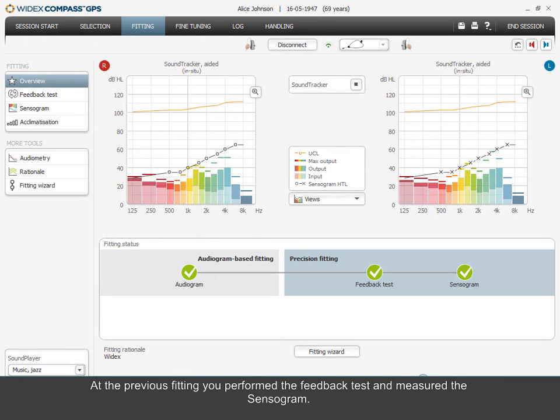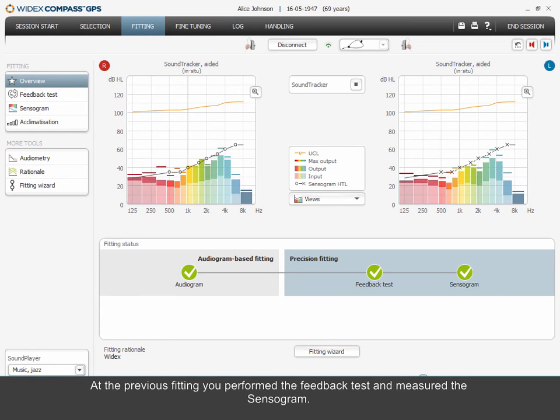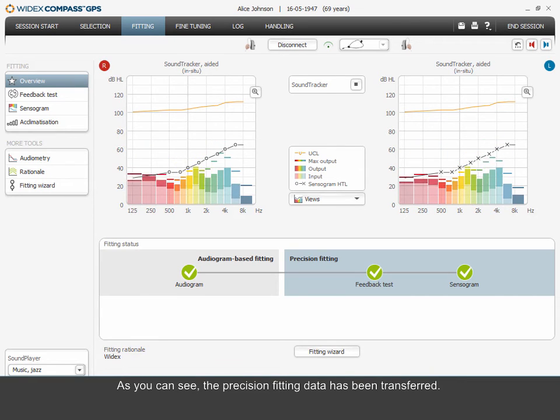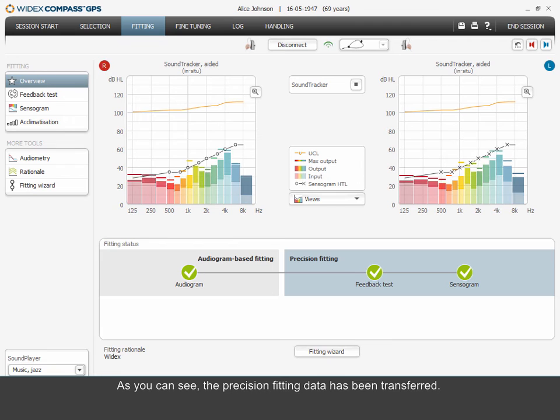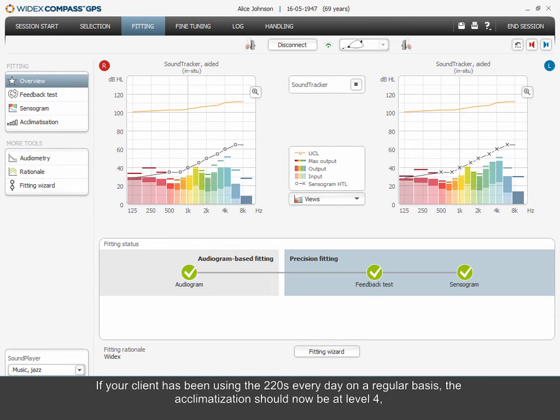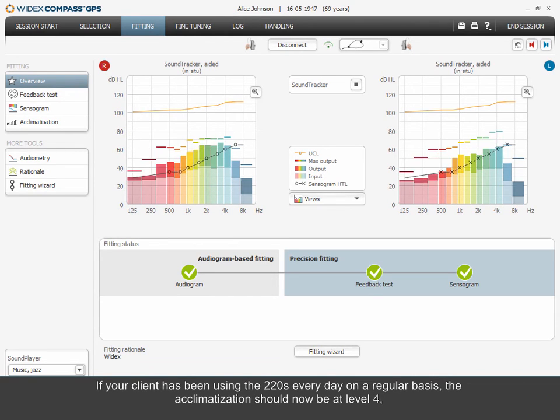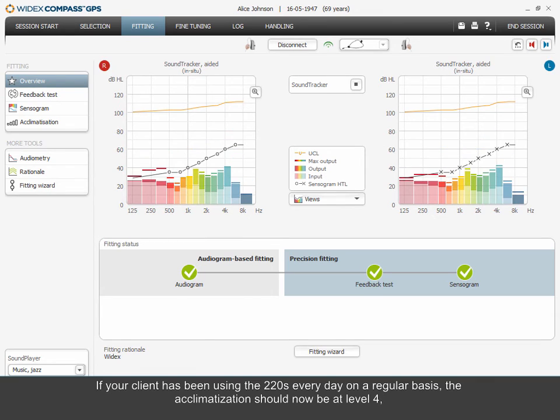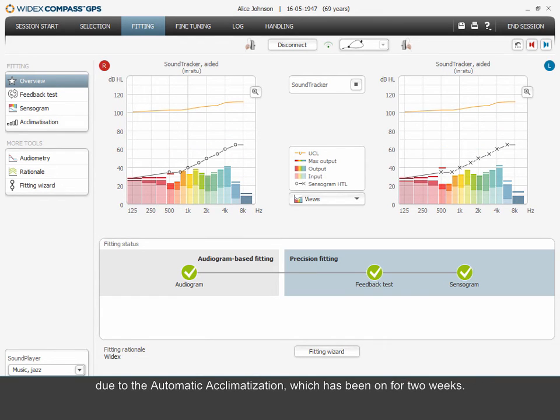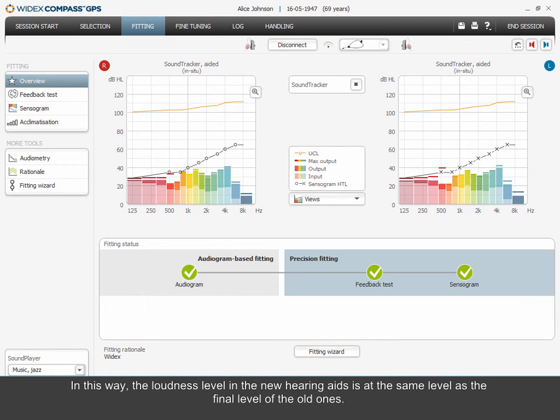At the previous fitting, you performed the feedback test and measured the Sensogram. As you can see, the precision fitting data has been transferred. If your client has been using the 220s every day on a regular basis, the acclimatization should now be at Level 4 due to the automatic acclimatization, which has been on for 2 weeks. In this way, the loudness level in the new hearing aids is at the same level as the final level of the old ones.